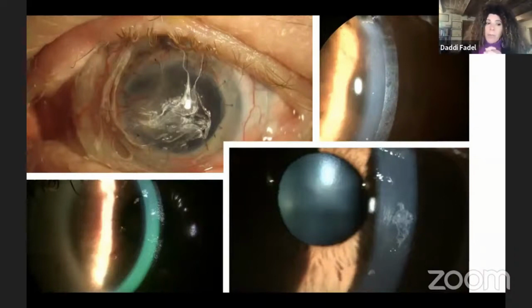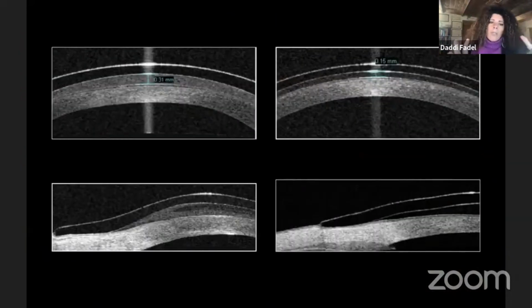We have three types of debris that may occur. Mucous debris appearing as small white particles, diluted milk fogging, associated with atopic diseases and ocular surface diseases. And you may also have oil droplet debris. So what you can do, reduce the limbal vault.